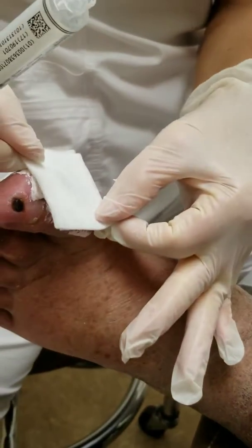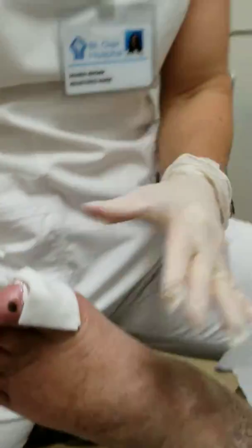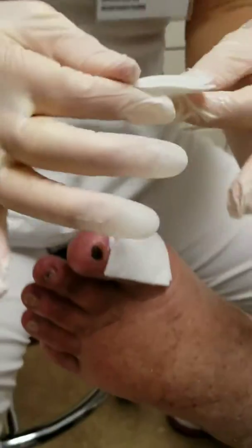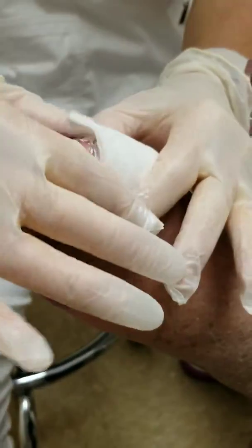That wet part goes right on the wound — keep them moist. You can take another dry one; it's totally up to you to pat it if you want.